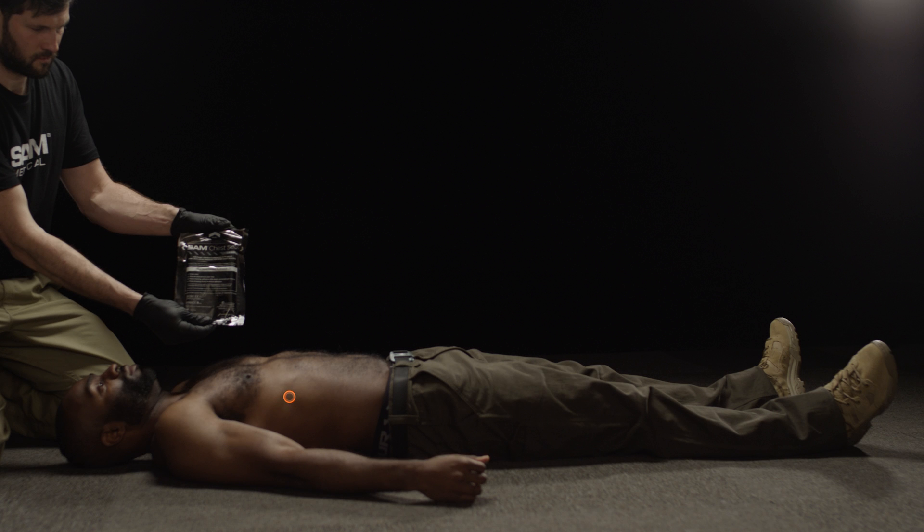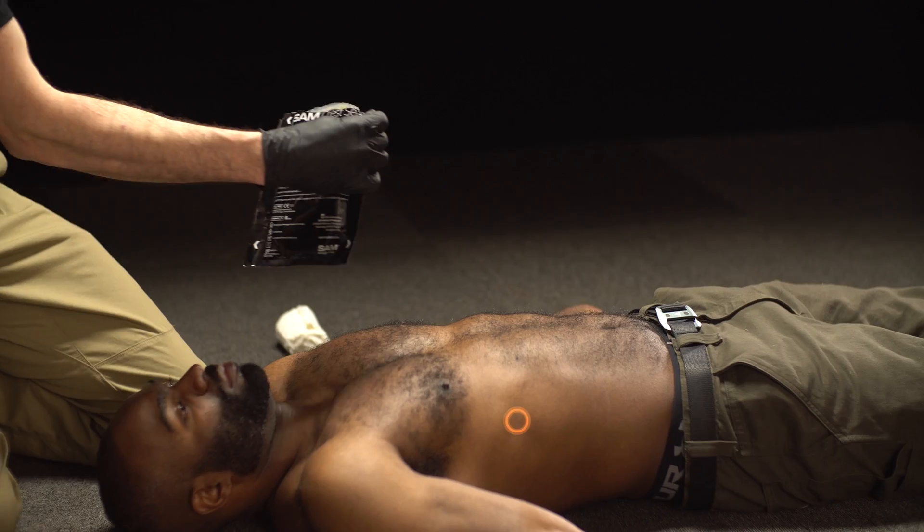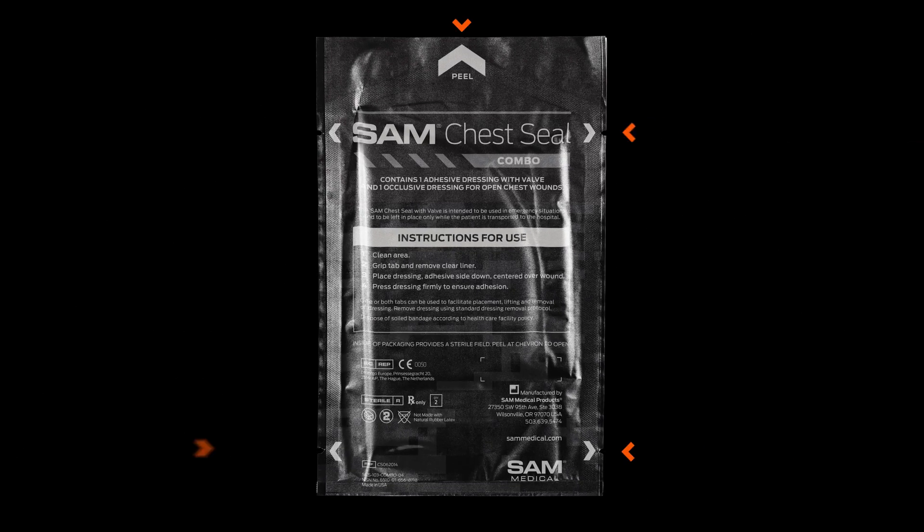Locate the wound and remove the casualty's clothes. Run your fingers on the patient's chest and back to ensure you've located all wounds. Quickly and easily open the sterilized SAM Chest Seal packaging by peeling it from tabs or tearing along the chevron-marked areas.